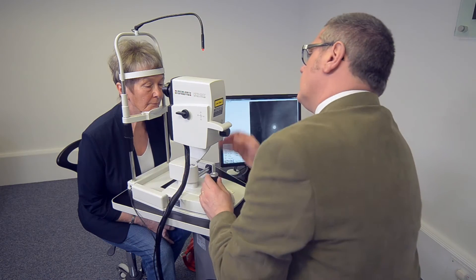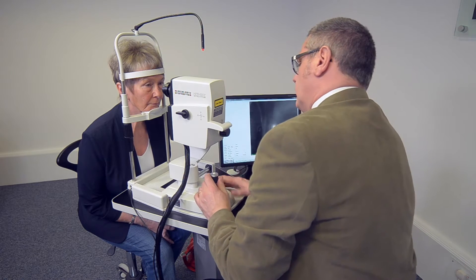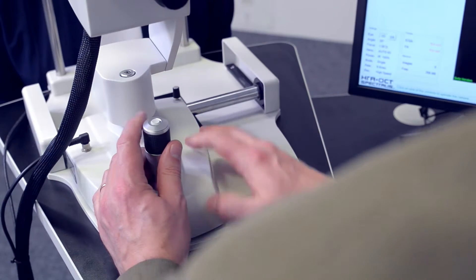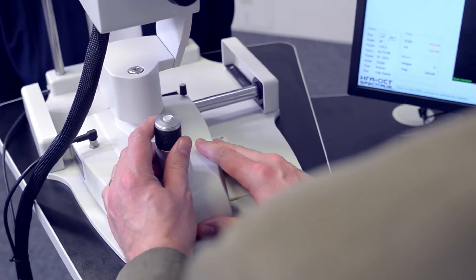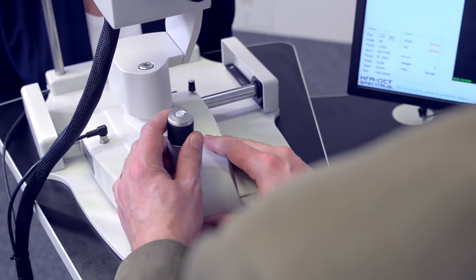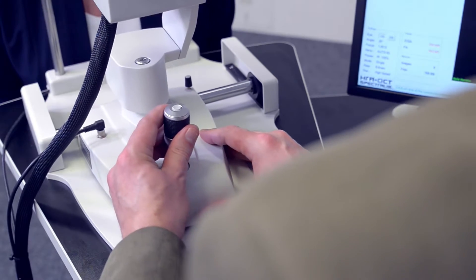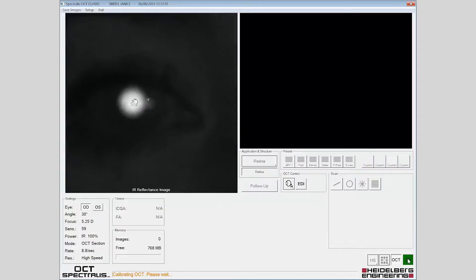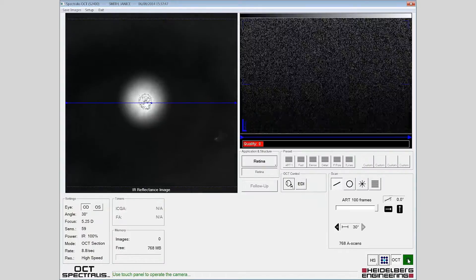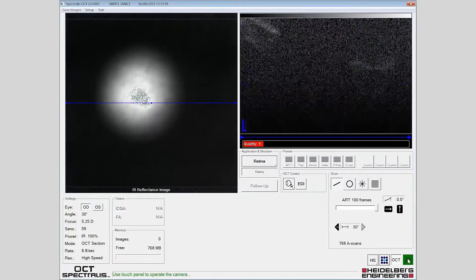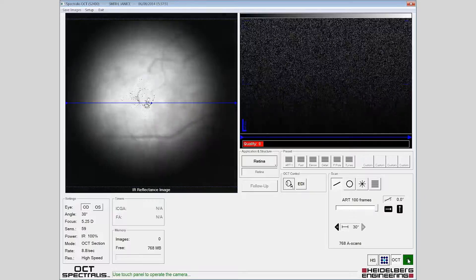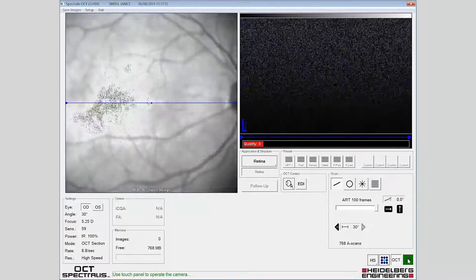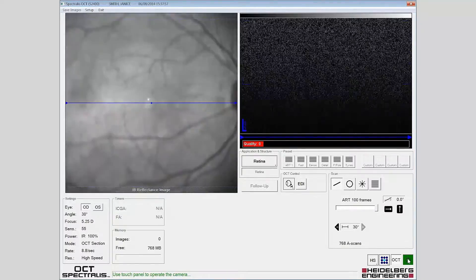The patient should be instructed to look at the internal fixation target. The fundus image is aligned by sliding the camera head forward, keeping the reflex from the patient's pupil central. The fundus image should be evenly illuminated from edge to edge.